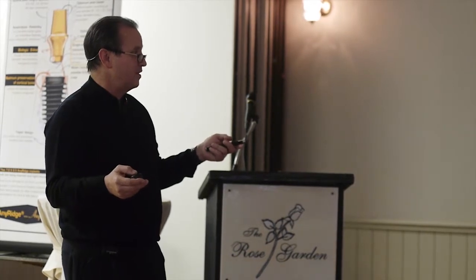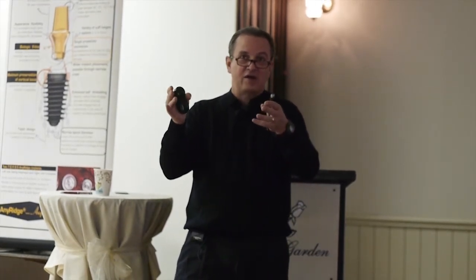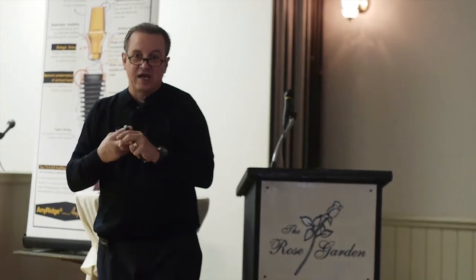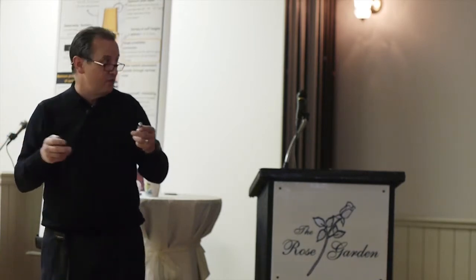But the thing that I want you to understand is taking his existing denture that he liked, converting it into a palateless implant locator-retained overdenture, and then making a copy of that and taking the final impression with that. So the lab could come back and make his final bridge with a metal reinforcement inside of it. And somebody was telling me that's the way McGinnis does all of his. He's got like an RPD, he's got a framework in all of them, because they will break them. Yeah, they really will break them.